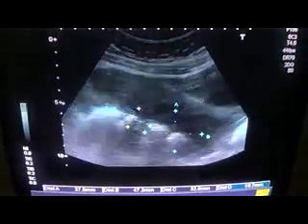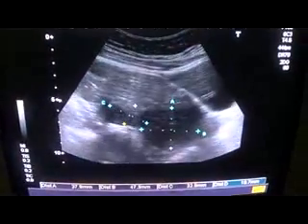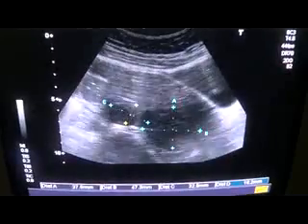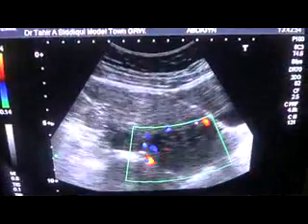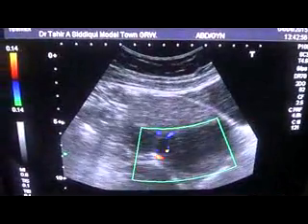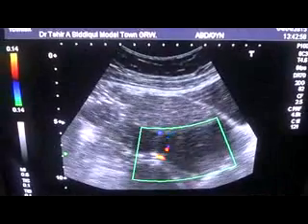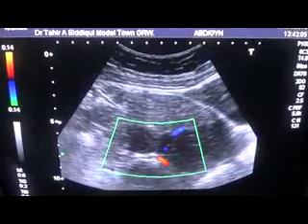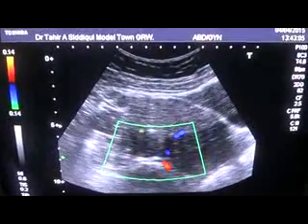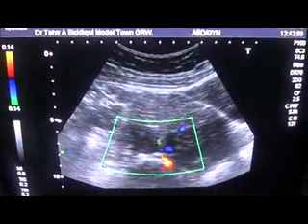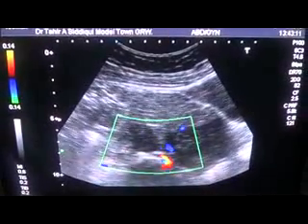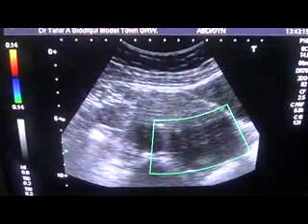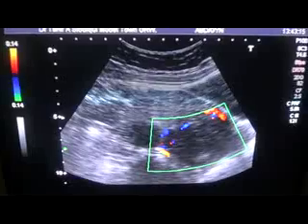This is the longitudinal section of the uterus. No blood vessels or flow is seen within either of these two masses. Marginal vessels are seen, though they relate to the myometrium more than the mass itself.